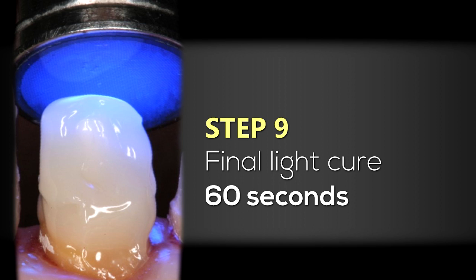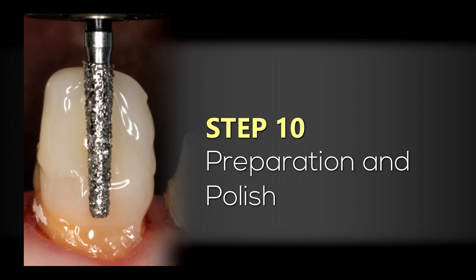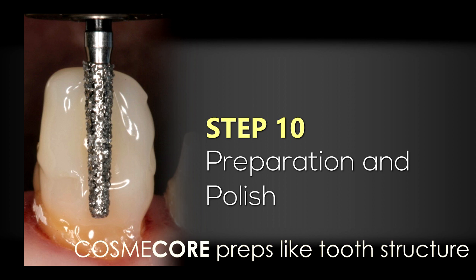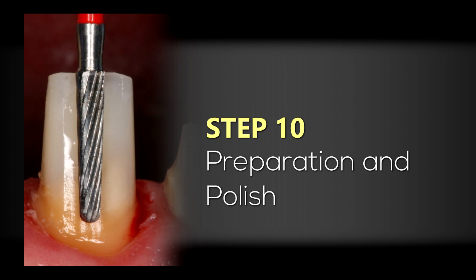With a traditional halogen light, I'm going to light cure my Cosmocore for 60 seconds, both from the facial and the palatal, to make sure the core building material is sufficiently cured. Once the Cosmocore has been adequately polymerized, I can go in with my traditional crown and bridge burs — this is a bur from Brassler — and create my preparation. What you'll find with Cosmocore is that it preps very similarly to tooth structure: it's not too soft and not too firm. I then refine and smooth the preparation with another Brassler bur.